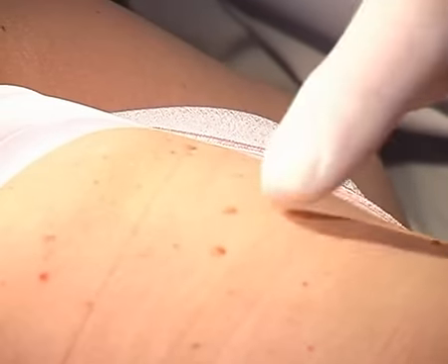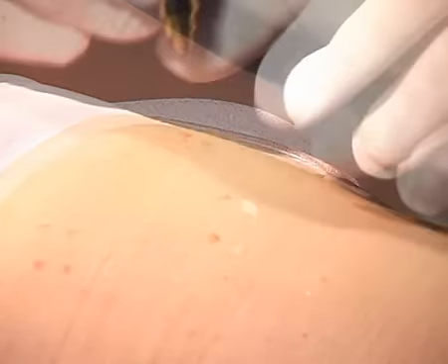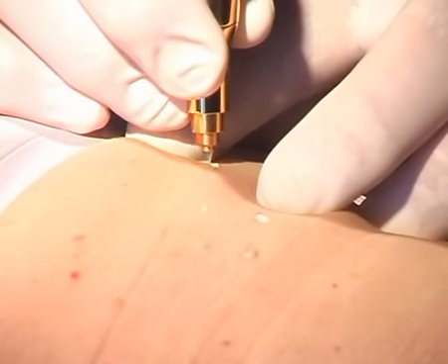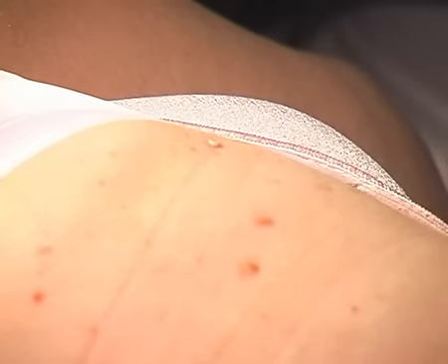The same patient feels annoyed by several small seborrheic warts. We are removing them again with a cryo-alpha perfect and are treating during 4 to 5 seconds. Once the crust is formed, they will also fall off within 10 to 14 days.